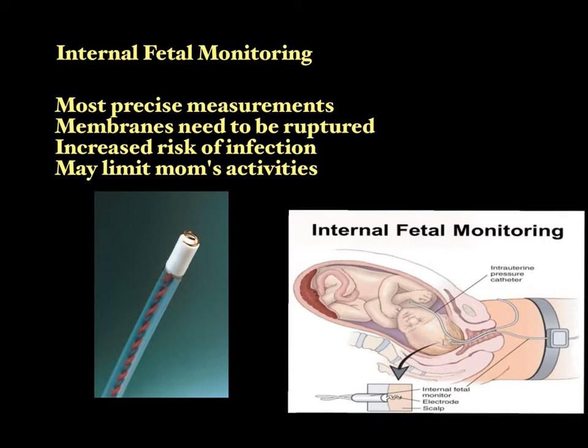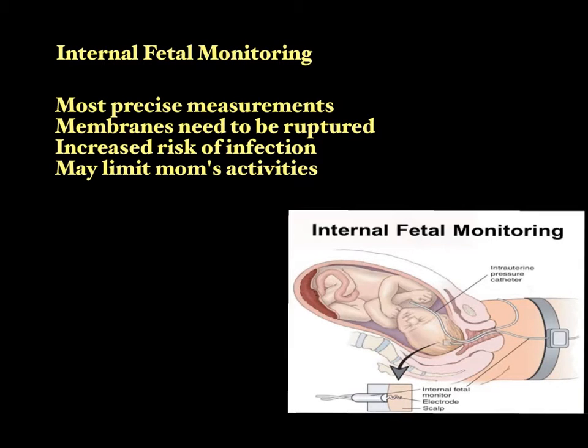Now the great thing about that is, as I said, you are doing exactly the beat-to-beat calculations, so you see everything really well. However, if mom has herpes or HIV or any other infection that could ascend and really hurt that baby, we're not going to use this.